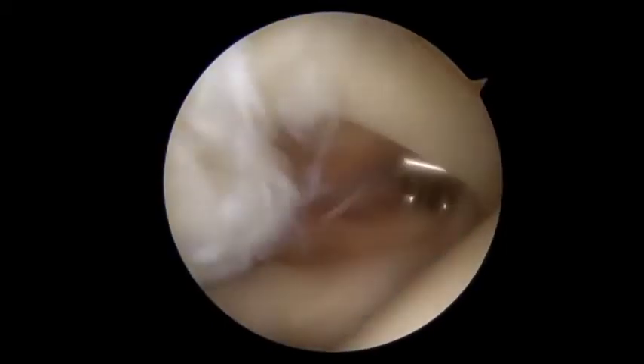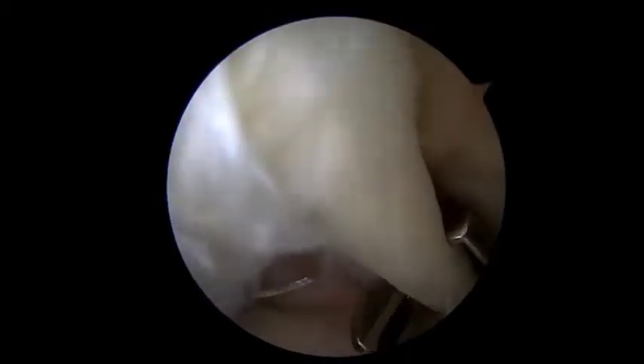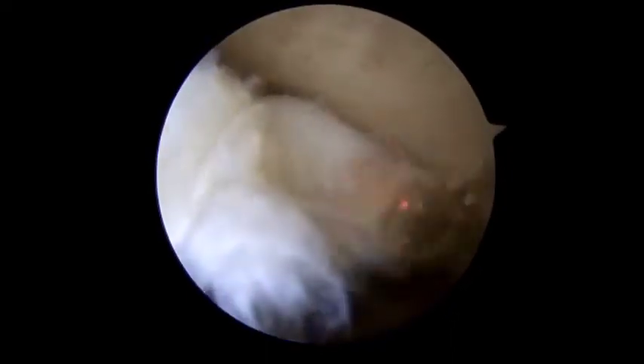At first, tagging of the long head of the biceps tendon using a fiber wire and scorpion needle. This is followed by tenotomy of the long head of the biceps tendon using coblation.